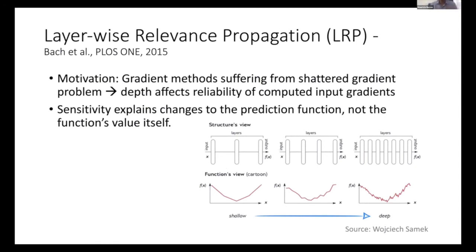deep architecture, your gradients start getting very, very small as you go inside the network. Because what happens is that you are multiplying with values that are lower than 1. By doing this many, many times, the actual value you are having is close to 0. So this is called gradient saturation, or shattered gradients.